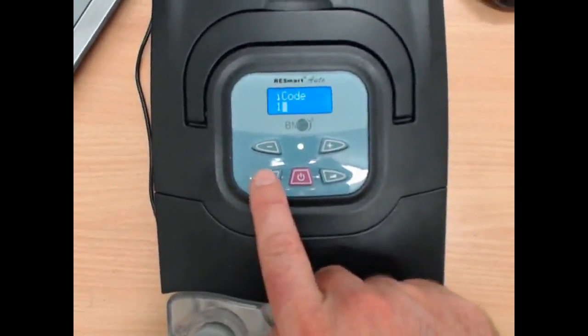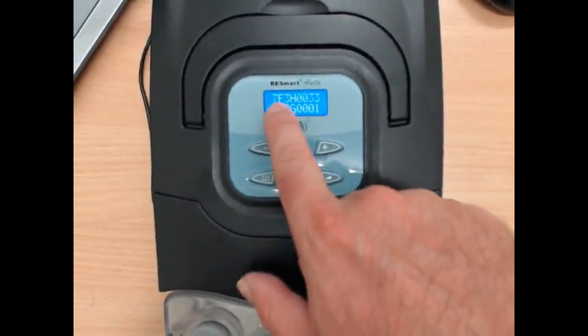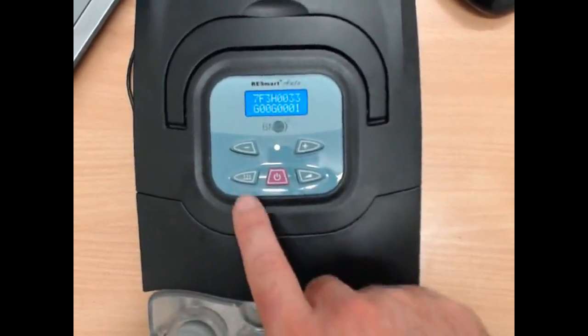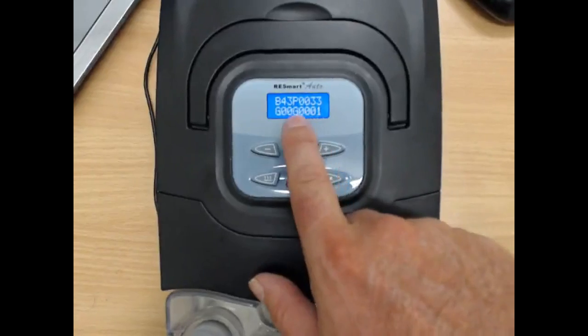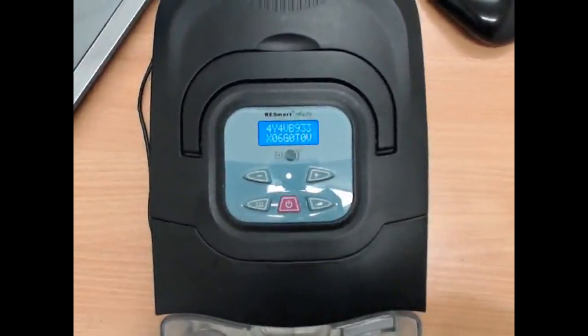So I just tap that and see how it says I code 1. If I press it again, it's going to give us a string of numbers. You need to write those numbers and letters down on a piece of paper. And then again press it and it will say I code 7. Write these numbers down next to I code 7. And then one more time I code 30 and write these numbers down.